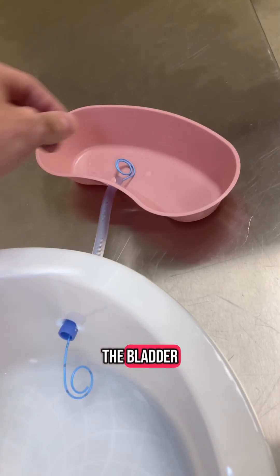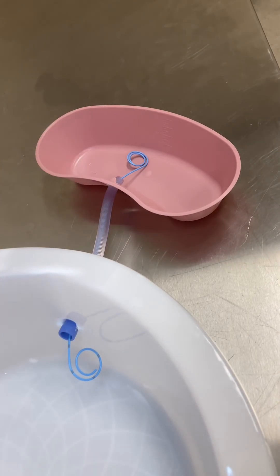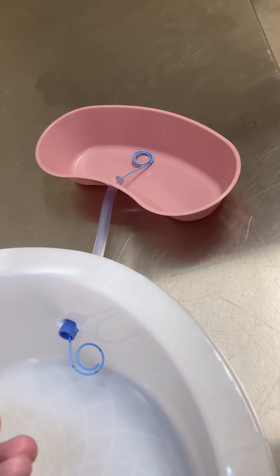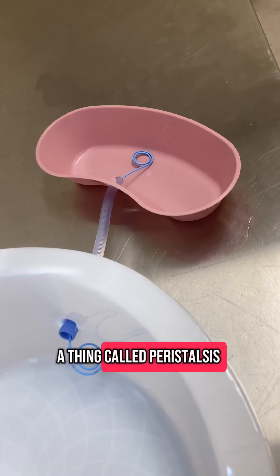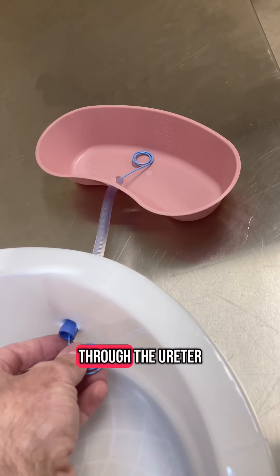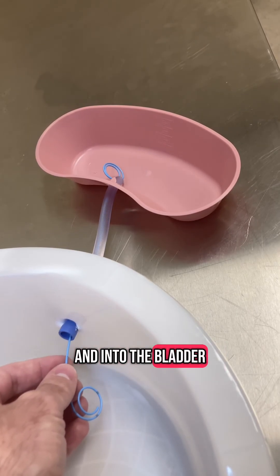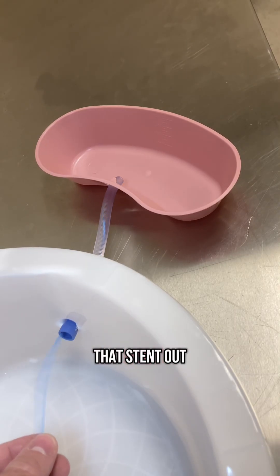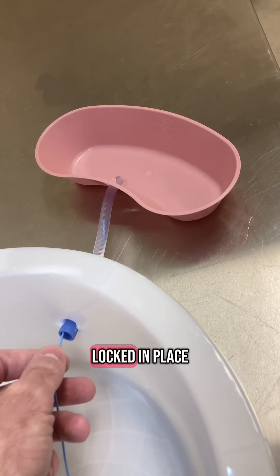You want this to curl in the bladder and curl in the kidney — that kind of locks it in place. Your ureter does a thing called peristalsis, which is how it moves the urine through the ureter and into the bladder. If the stent looks like it's not curled, peristalsis will slowly work that stent out of there. So you want that to be locked in place.